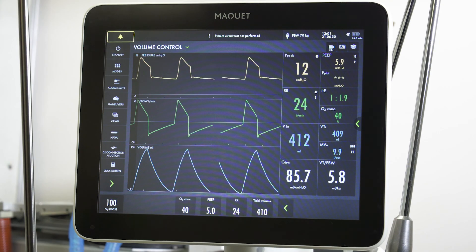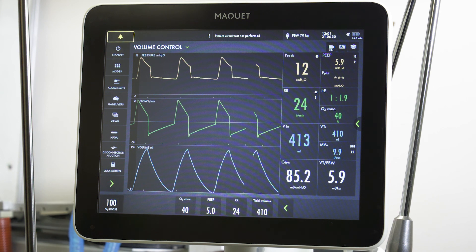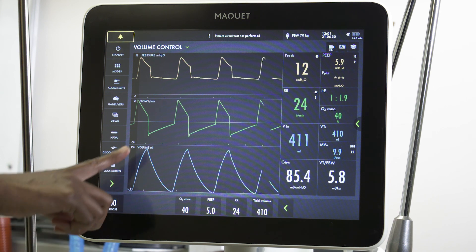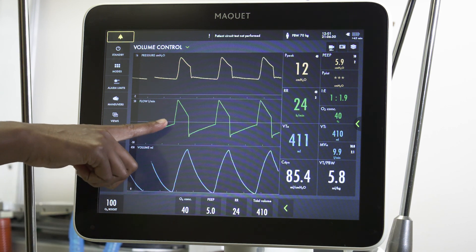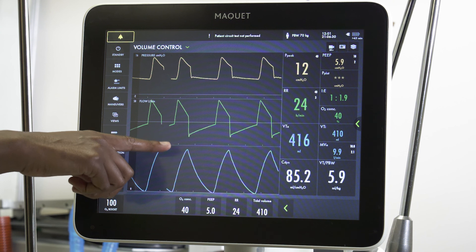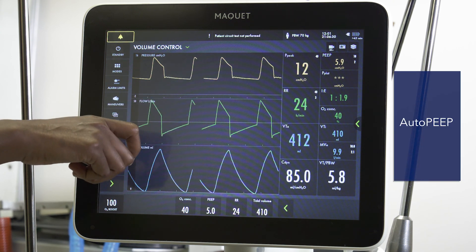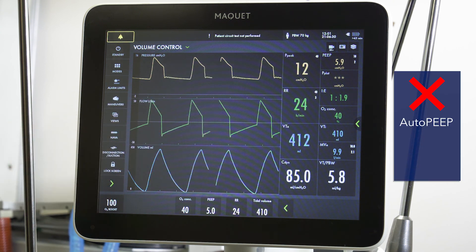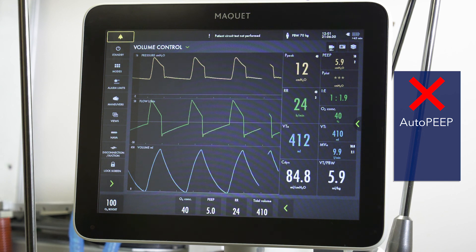As you can see in this patient, the expiratory flow line does not return to zero before the next breath is triggered by the ventilator. This is indicative of auto PEEP, and is a patient in whom you may want to consider making modifications to their vent settings and/or sedation.